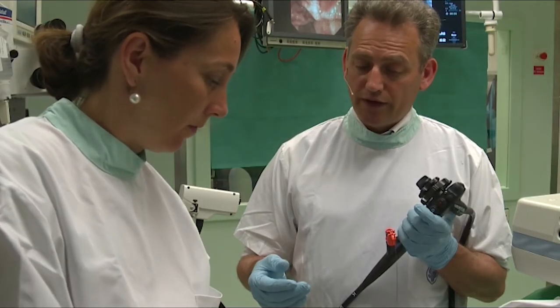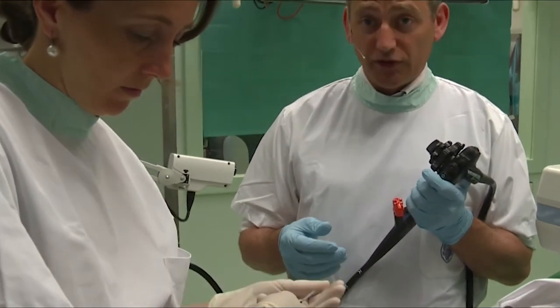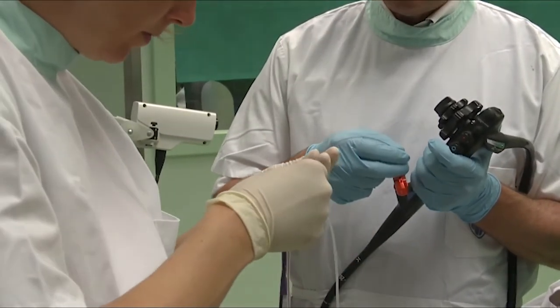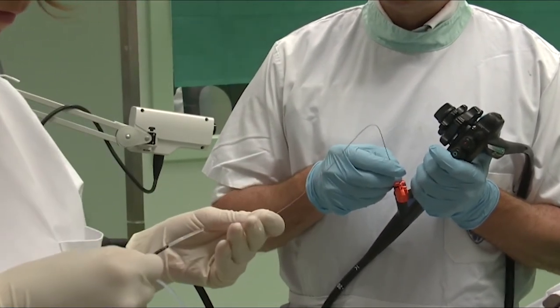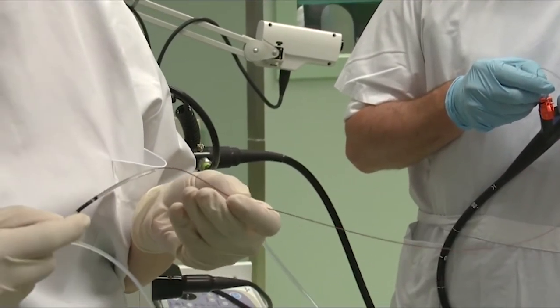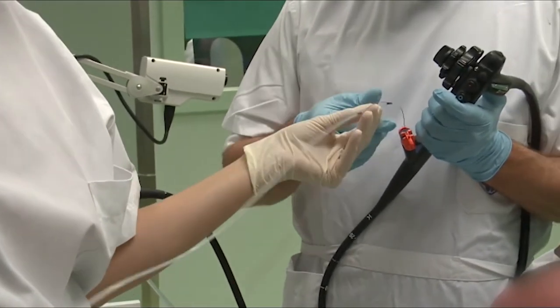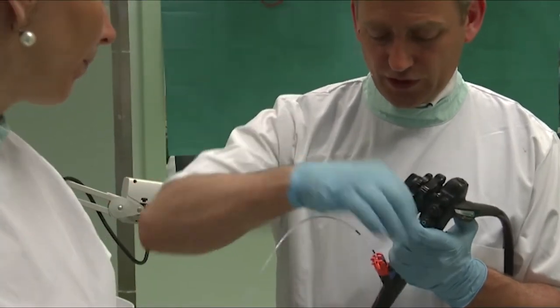Next what we will do is take some brush cytology. So next we will try to get some cytological confirmation of the presumptive diagnosis of a pancreatic malignancy, which on CT scan at least, shows signs of irresectability, which would then mean that the patient will be suggested for chemotherapy, of course, for which we need a definite diagnosis. So we now introduce the brush cytology device.